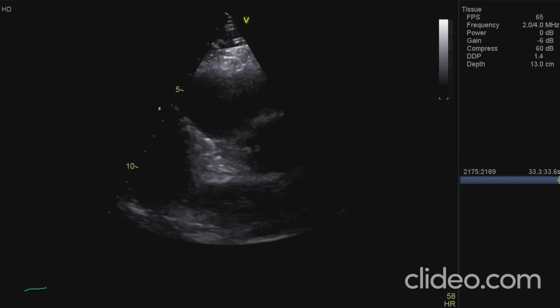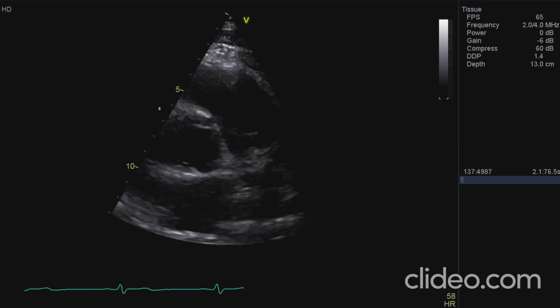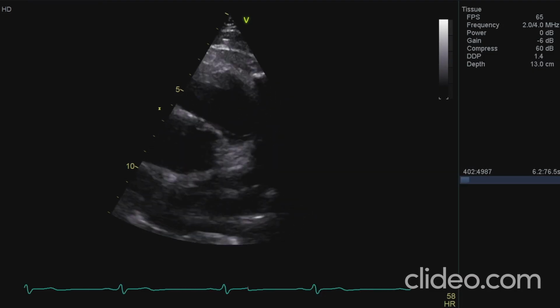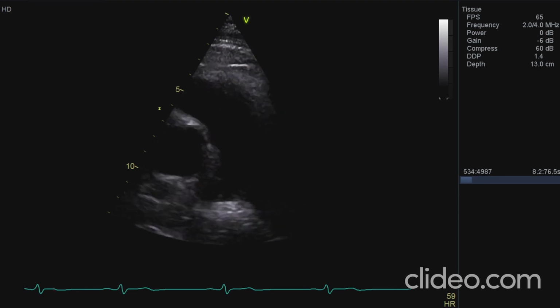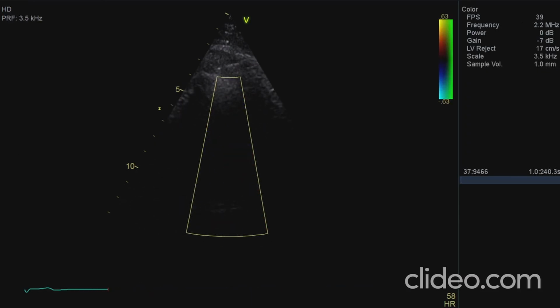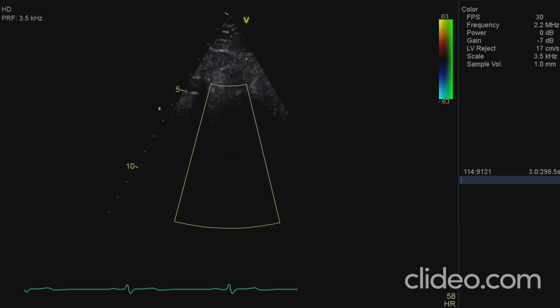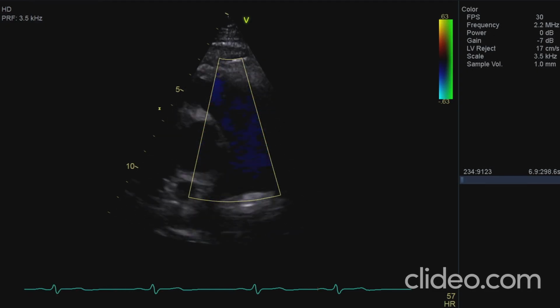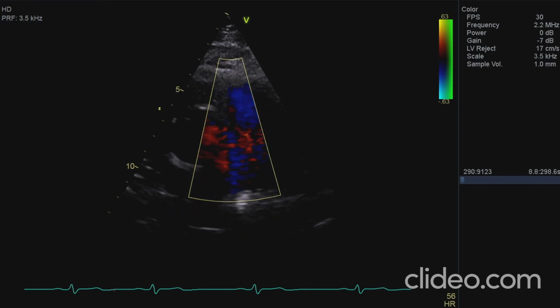It's going to want me to do the pulmonary artery diameter, so I'm going to swap round now. I'm going into a parasternal short axis view. Now it's quite difficult to see exactly where that diameter stops and starts, so I typically put on colour to give me some guidance to where the walls are. Okay, so that's giving me a bit of an idea.